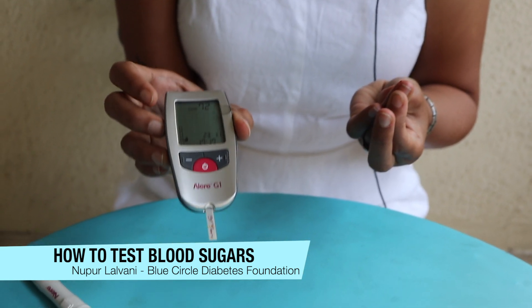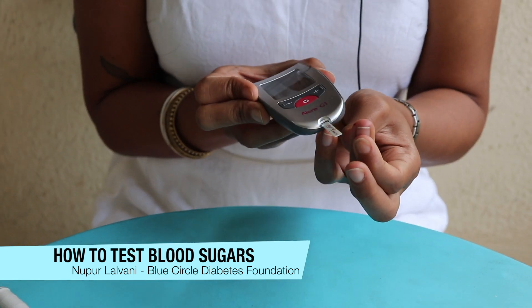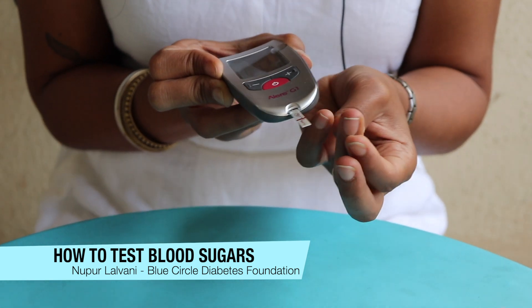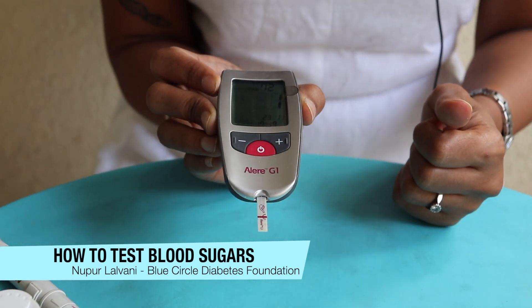When you see this little drop on the meter, that usually indicates that you're ready to put the blood drop on the strip. You put the drop on the strip and then you wait for a few seconds until it counts down.